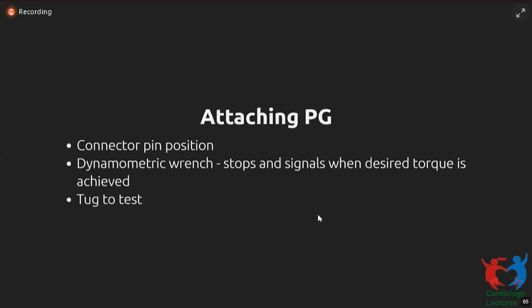With multiple leads, with dual chamber devices, CRTs, ICDs, etc., take a lot of care to see that the right lead is fixed in the right slot. So you may be able to identify this based on markers on the lead. Sometimes it's marked as a 58 centimeter or 52 centimeter lead. Leads are also sometimes not compatible. For example, with ICDs, the ICD leads have a different profile. They're called DF1 leads compared to the IS1 for the pacemaker lead. So you might be able to identify based on that.